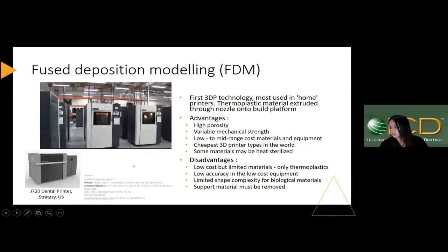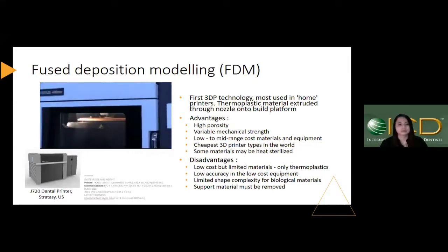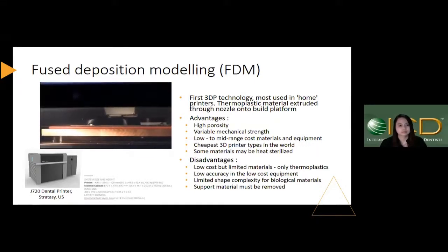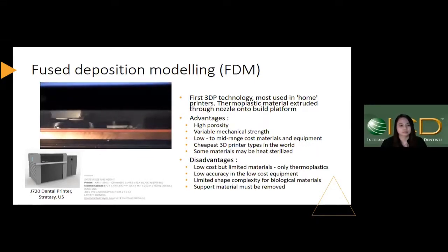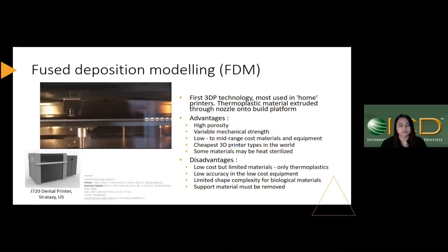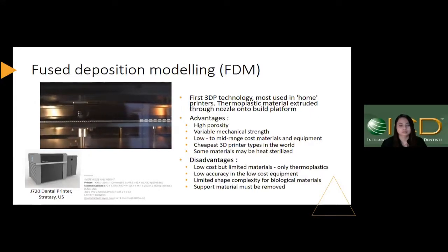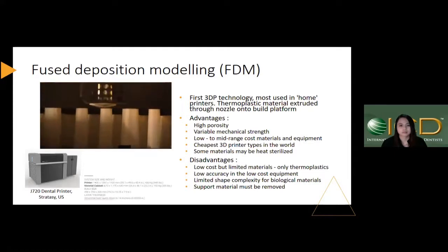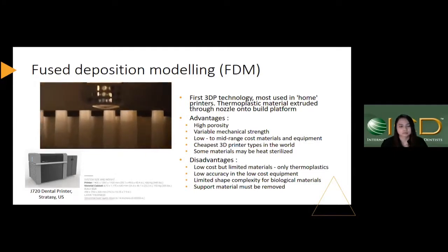Fused deposition modeling, or FDM, is a layer additive manufacturing process that uses production-grade thermoplastic materials to produce both prototype and end-use parts. This technology is known to accurately produce feature details and has an excellent strength-to-weight ratio. FDM is ideal for concept models, functional prototypes, manufacturing aids, and low-volume end-use parts.